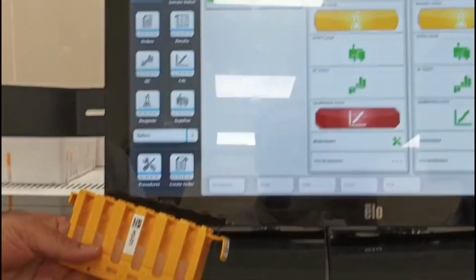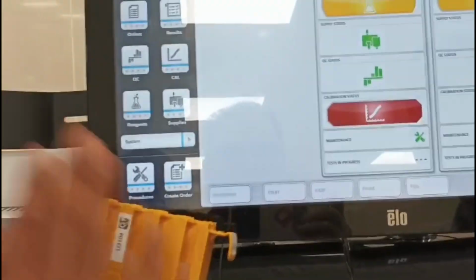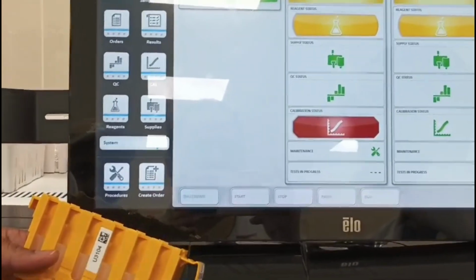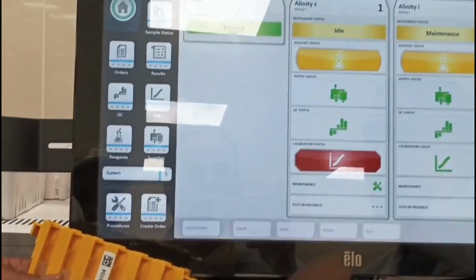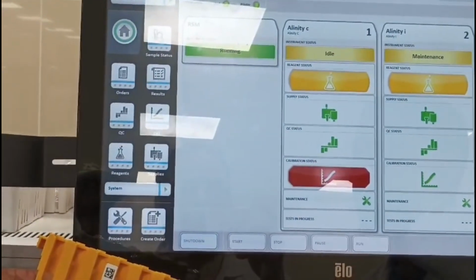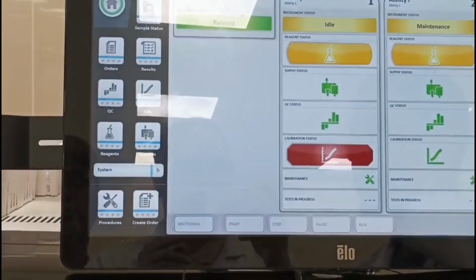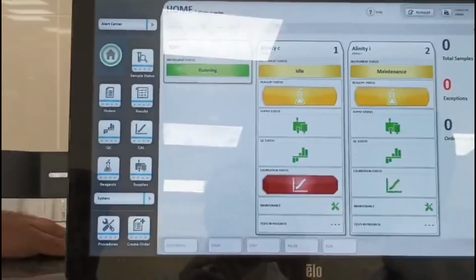This machine, you keep it inside for 7 days. The machine already stores 7 days. Don't take it outside. After 7 days the machine automatically takes calibration. No need to make it every day. You understand? That machine we are making every day, but here one time you can load for 7 days. For example, today you loaded this calibrator, then 7 days keep it inside.